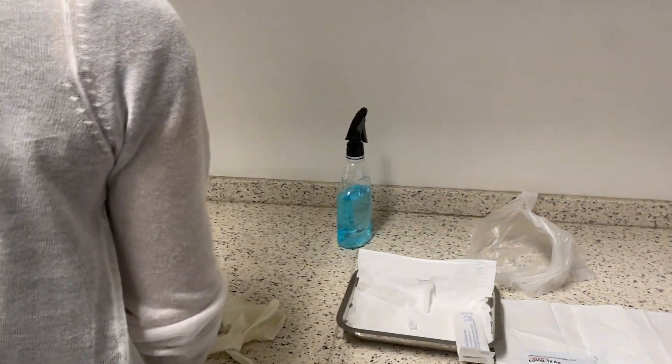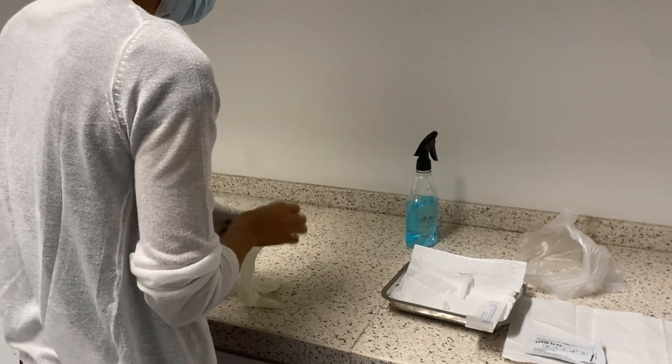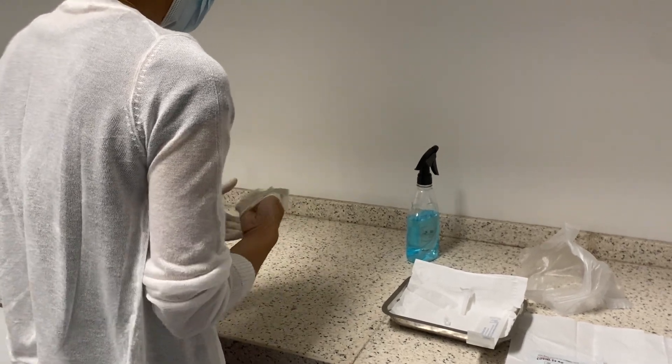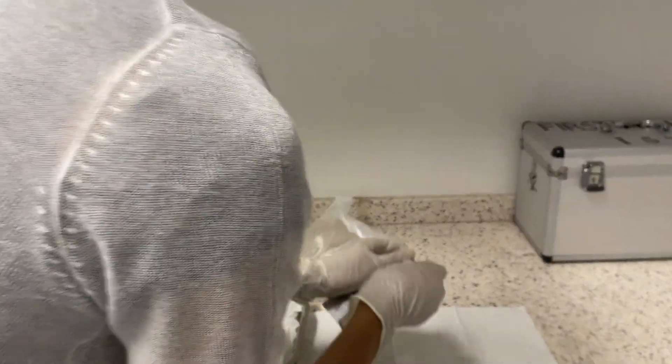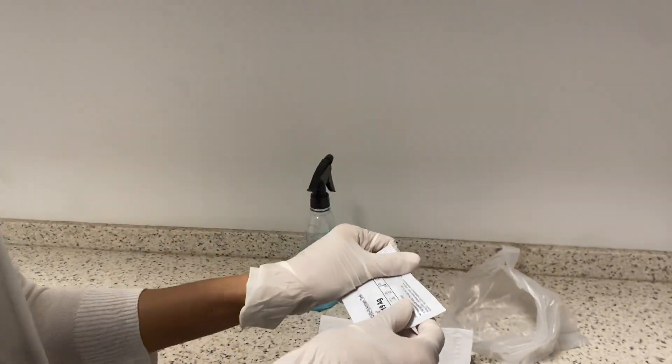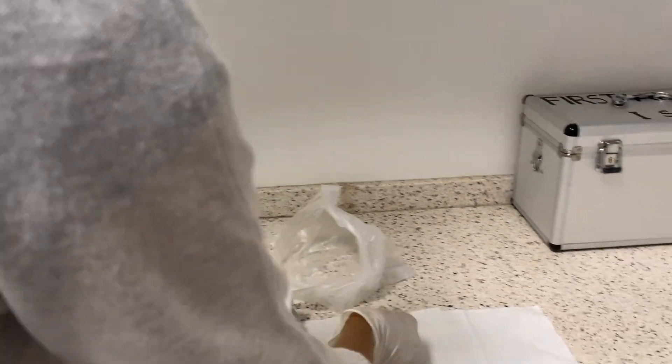I will put on my glove. And then open the cassette and prepare it.